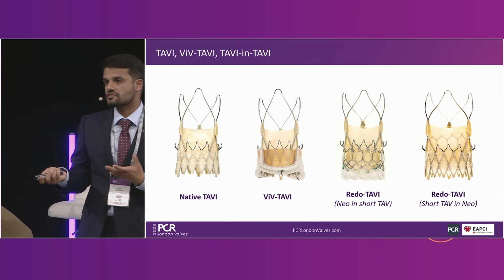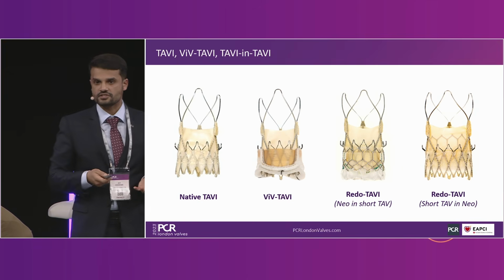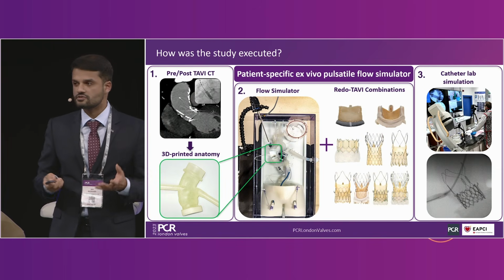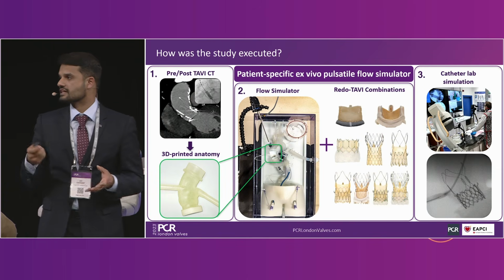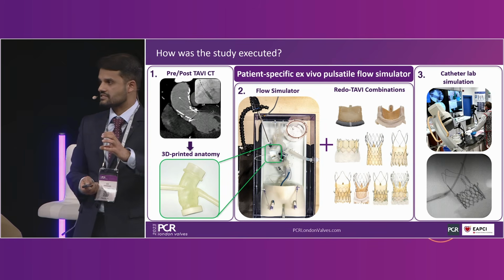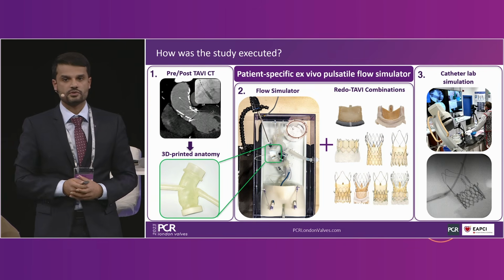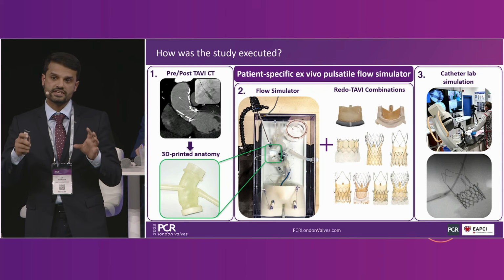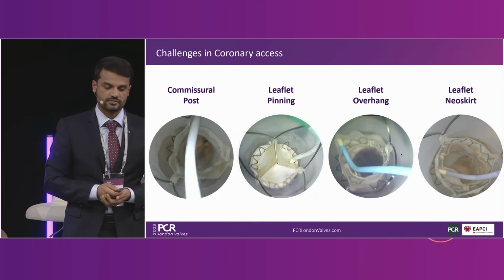Now, for us, it's obviously impossible to go inside of patients with multiple different catheters and multiple different TAVI combinations. So we really use a patient-specific pulsatile flow simulator approach, whereby we can take any patient, make the anatomy, take any combination of valves that we want, and then just play, essentially, inside with different catheters. With this methodology, I'm going to share with you some insights.